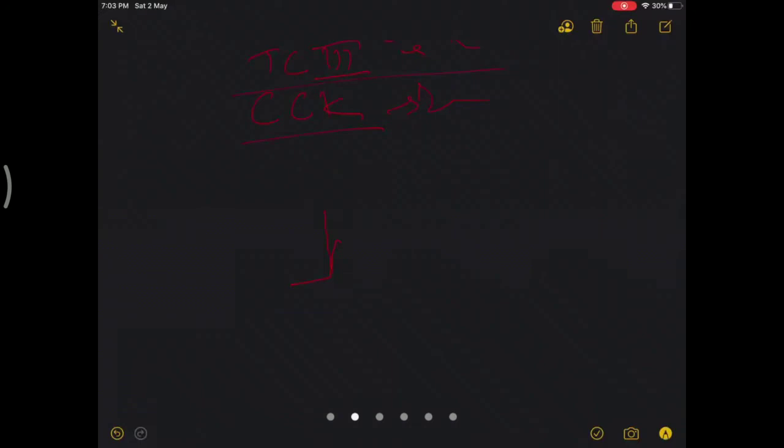They have increased the length of the post, and rather than just making a cam on the femur, you make side walls to the femoral prosthesis which grasp this post. This will not allow the varus valgus forces, which are constrained by these side walls and by the increased length of the post. Though there is some amount of toggling, it is one of the ways in which you can have a varus valgus constraint.